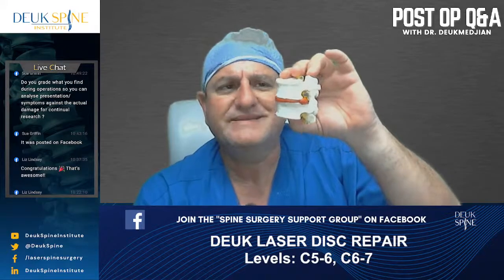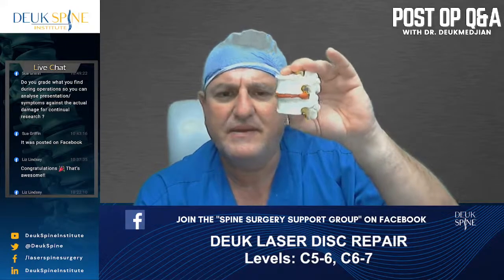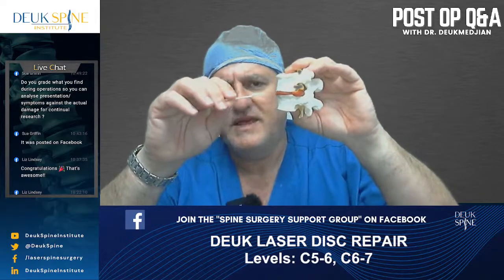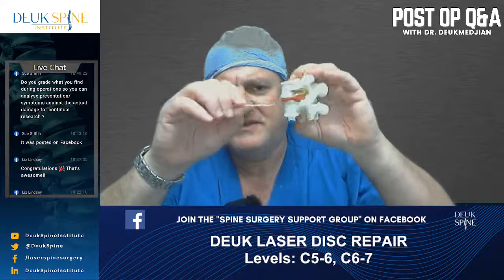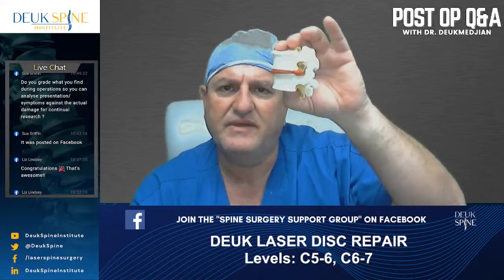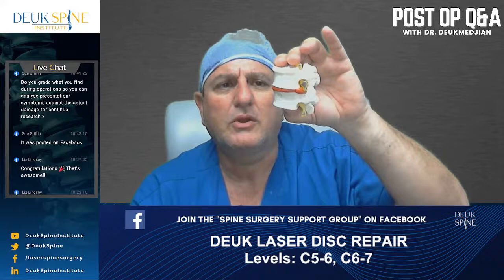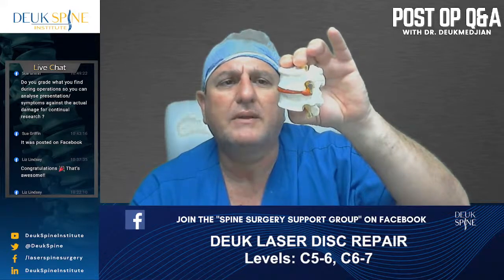So what the Koreans started doing, and there's some history to this, back in the 90s, was figure out they could actually go through the disc with a tiny tube, get to the back and zap out that herniation, unpinch the nerve. And I learned that technique from them shortly after they discovered it, literally within a few years. I went over there and learned the technique from the leaders in the world that were doing it. And then I brought it back to the States.